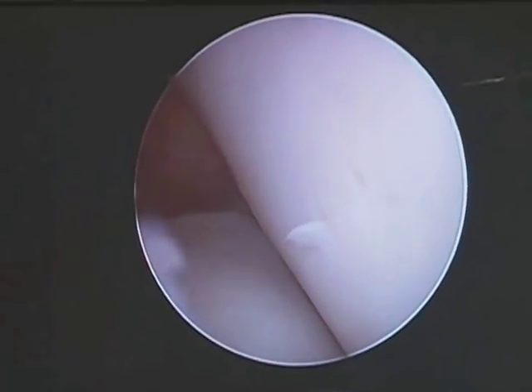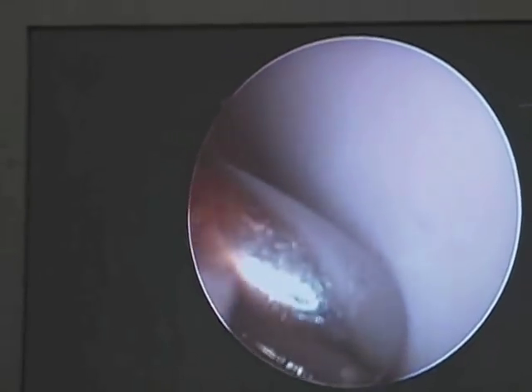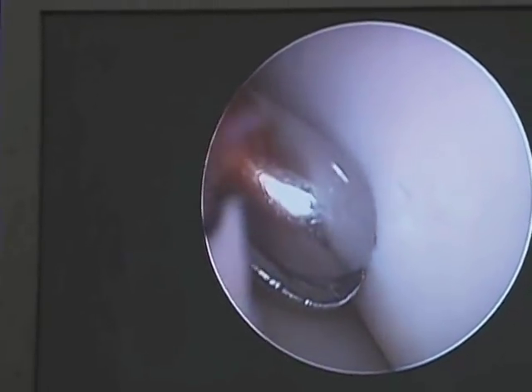The good thing about this joint is the color of the cartilage — very white, should be opaque. The joint that starts to get arthritis, this surface becomes yellow and furry looking, which we call fibrillation.